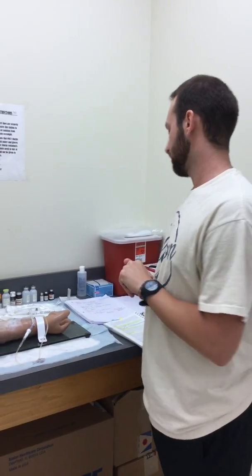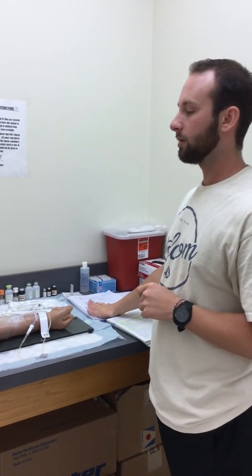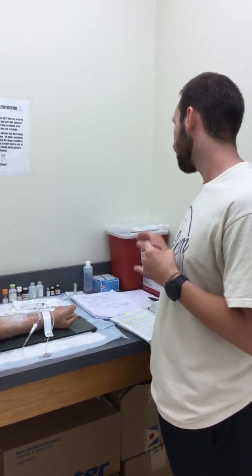Okay, this is my IV push back and push competency. The first thing we're going to want to do is compare our order to our MAR and make sure we have the right patient name, the right medicine, the right time, the right dose, the right route, and right administration. Make sure it's the right medication. And we're going to want to check for allergies.